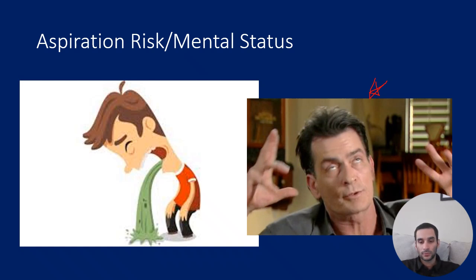Okay? This is especially helpful in a patient, for example, with bad COPD, and they have a little bit of hypercarbia where they're not quite ventilating well, and this will actually fix them and help avoid intubation, and so that can be a real advantage, but you have to use extreme caution. I'm saying this online, so I'm saying very clearly this is not the textbook answer.